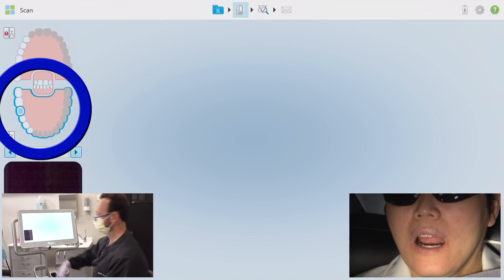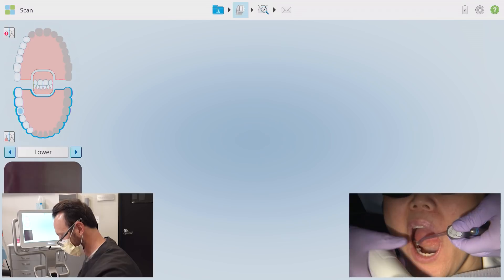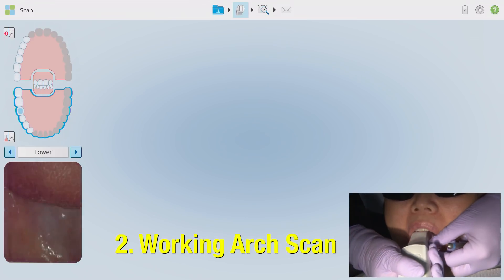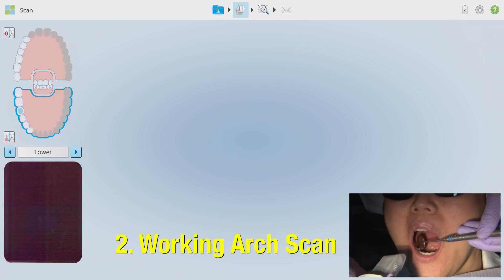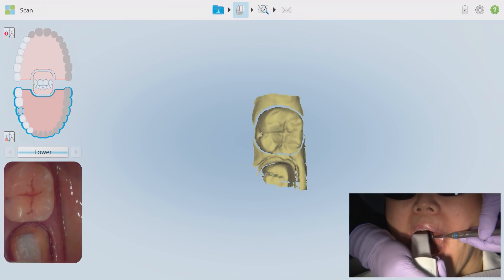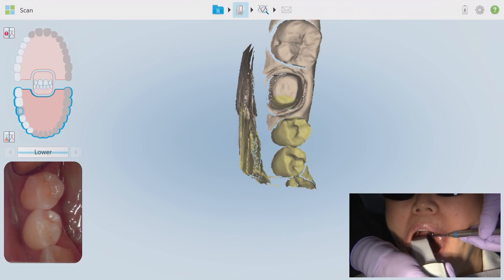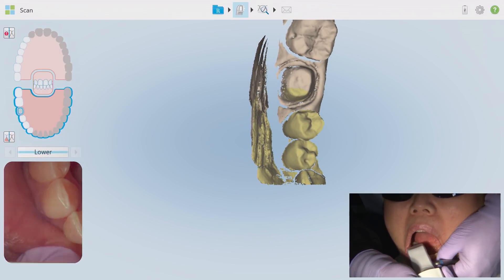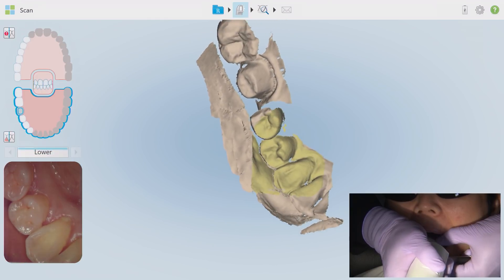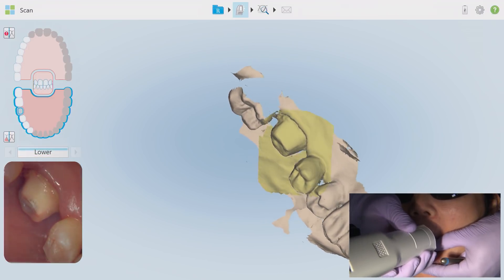Now satisfied with the preparation scan, I'm selecting the rest of the working arch and continuing. I'll give the quad a quick suction or air blast before setting the wand on the occlusal surface just distal to the most posterior tooth in the arch to start the scan. I'm scanning the occlusal surfaces first and moving towards the anterior. Once I arrive at the cuspid area with more incisal edge anatomy, I'll angle the wand a little more lingually inclined instead of facing straight down. I then bring the wand back towards the posterior and scan the lingual, making bold twisting motions back and forth throughout the arch.